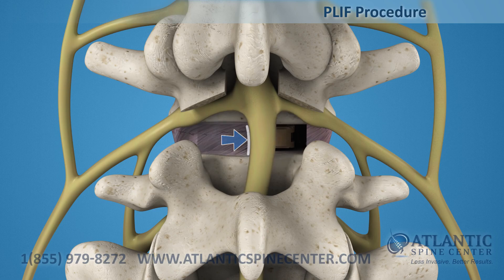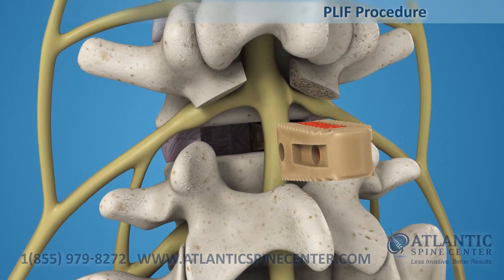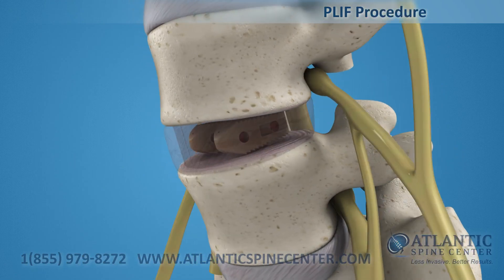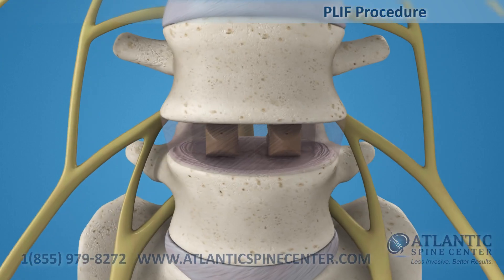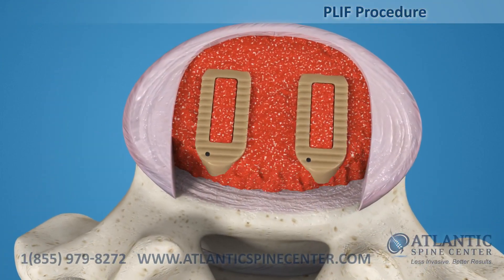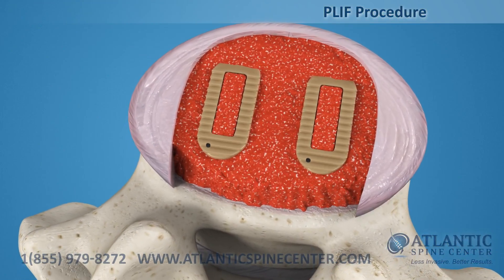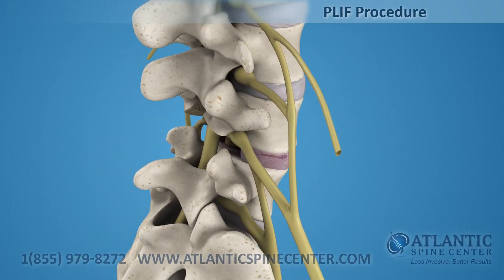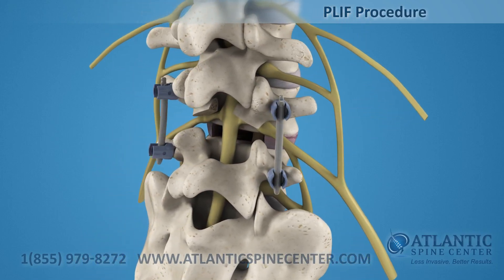The procedure is repeated for the other side. Additional bone graft may be placed around the implants to increase the surface area for fusion. This procedure is normally accompanied by a posterior fixation with pedicle screws.